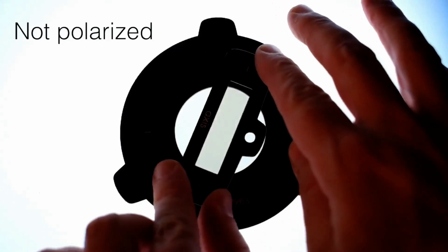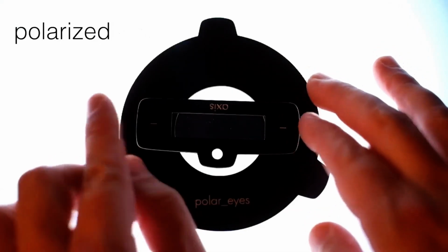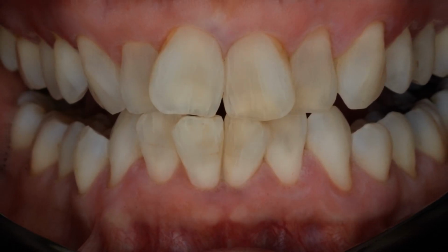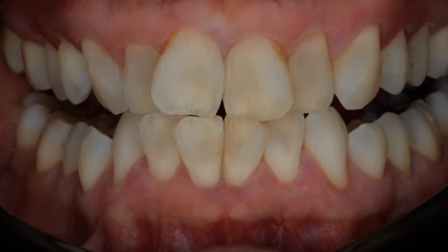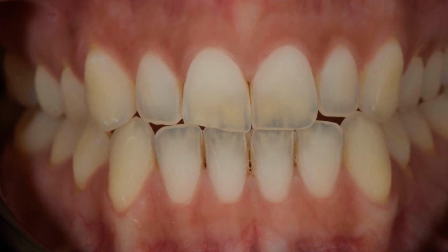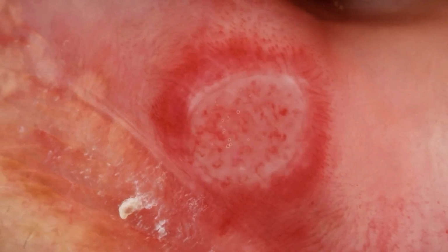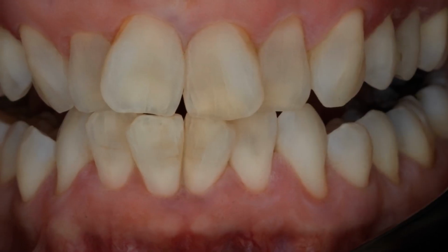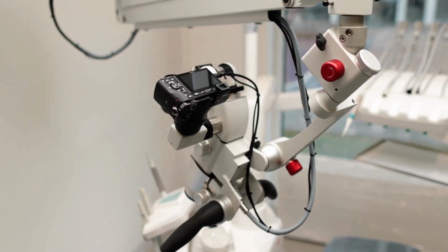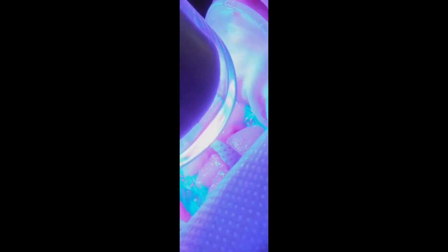These filters are aligned perpendicular to each other, effectively blocking out light waves oscillating in a specific direction. This selective filtering significantly reduces glare and specular reflections, revealing the underlying textures and colors with remarkable clarity. The result is a set of images that are not only aesthetically superior, but also diagnostically richer. By eliminating the distracting glare, cross-polarized photography allows dentists to visualize the intricate details of teeth and oral tissues, leading to more accurate diagnoses, more effective treatment planning, and ultimately, better patient care.